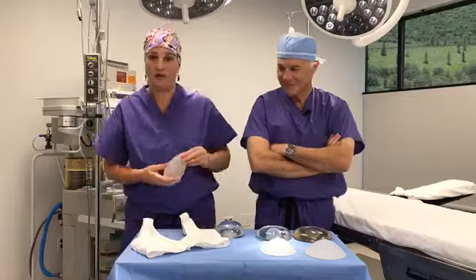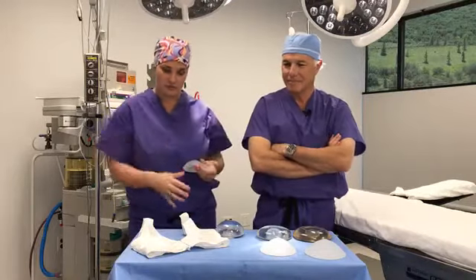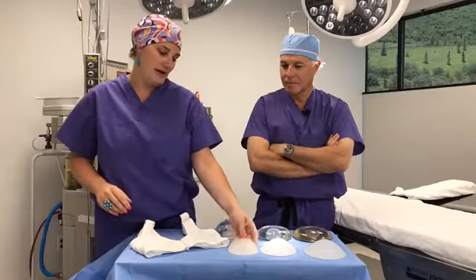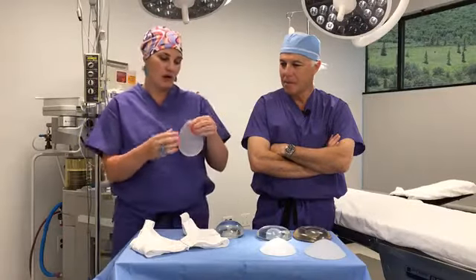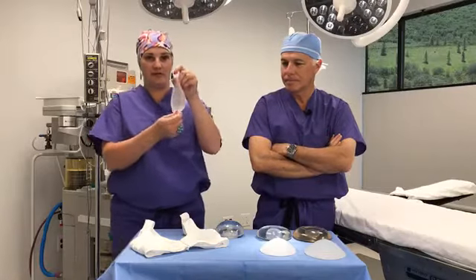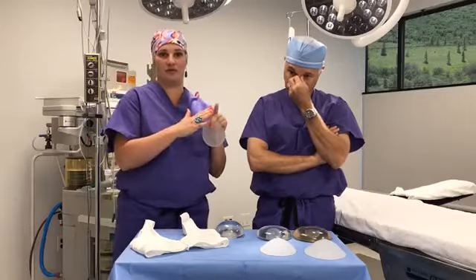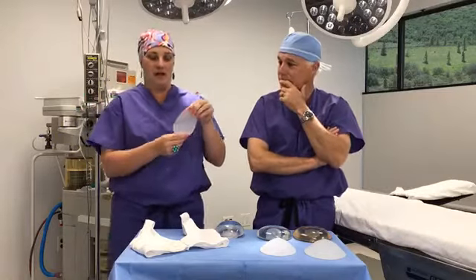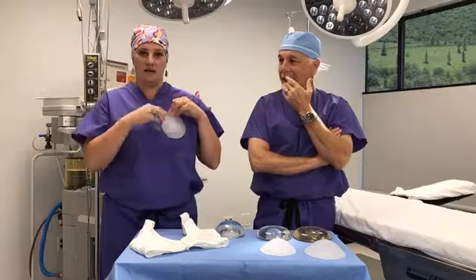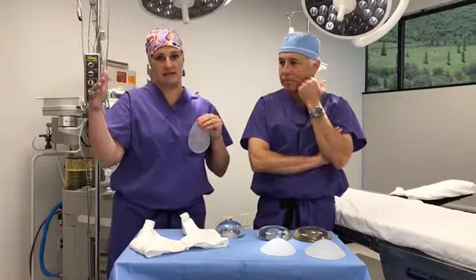I've had people bend over to see the weight, to see if they're going to feel the weight on their shoulders using the bra as well. And we just slowly work our way up. I'll put in, for example, 150 cc's. If Dr. Kopitz says our range to try on is anywhere from 200 to 350, we'll put the 150 in, and then there's another little 51 that I'll slip in, and we'll slowly work up to the sizes.